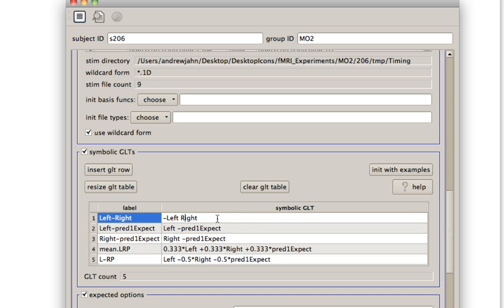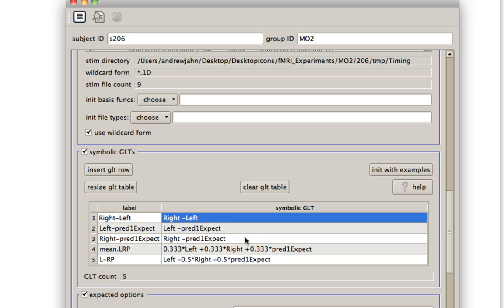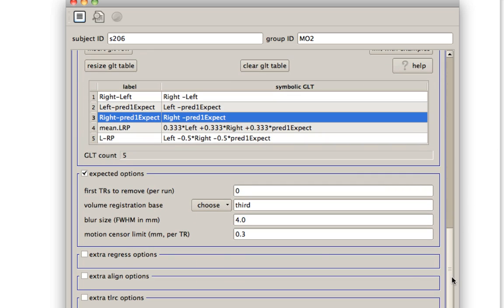This is a similar type of contrast. It might make more sense to do it like this. So you see the idea here, you can change these as you please. You can assign different weights to different regressors if you also want to do that. Hopefully the rest of these, like insert a row or clear the table, should be pretty self-explanatory.